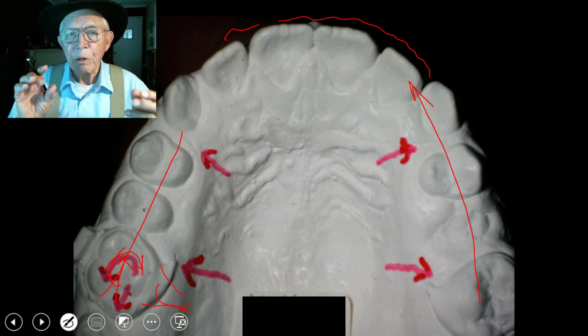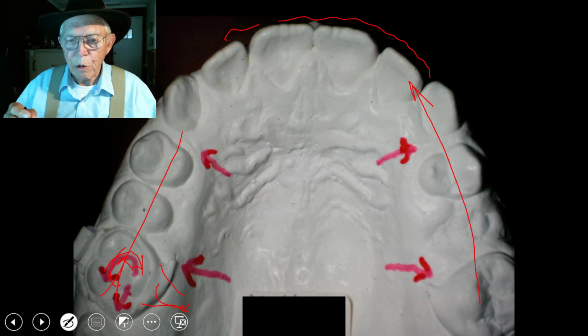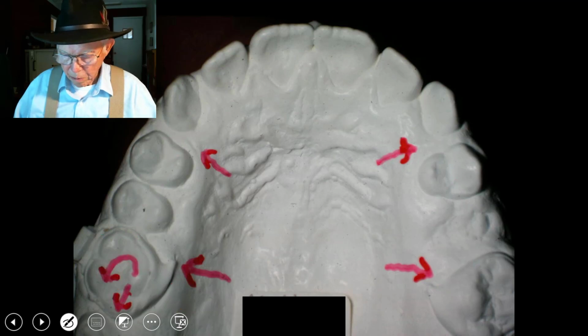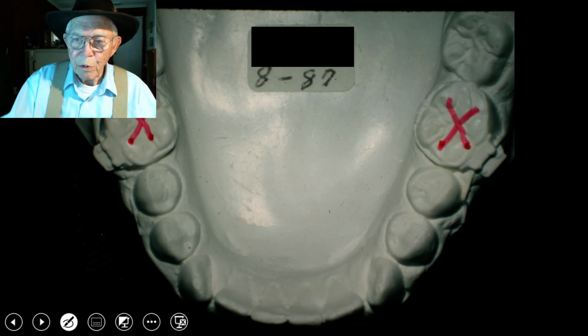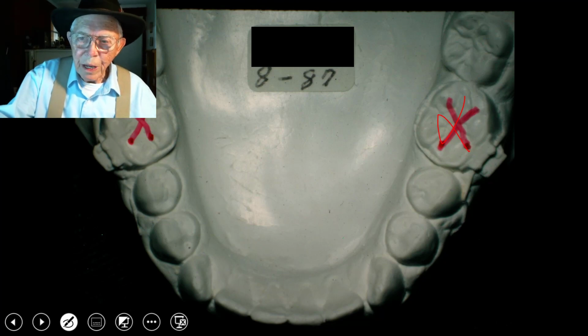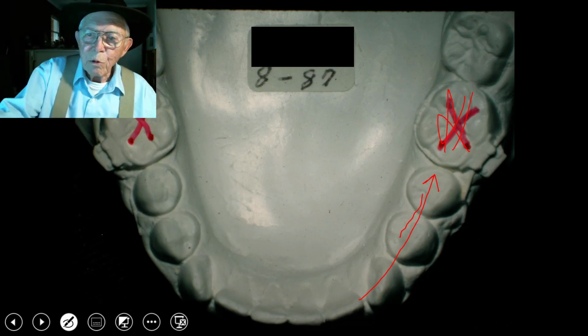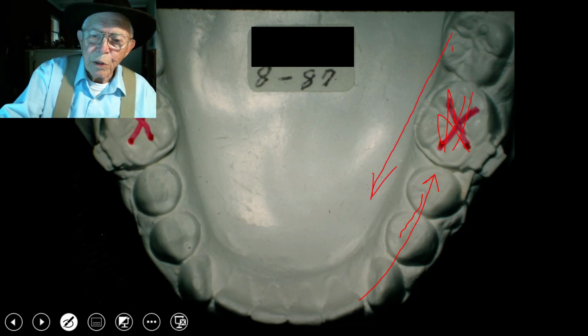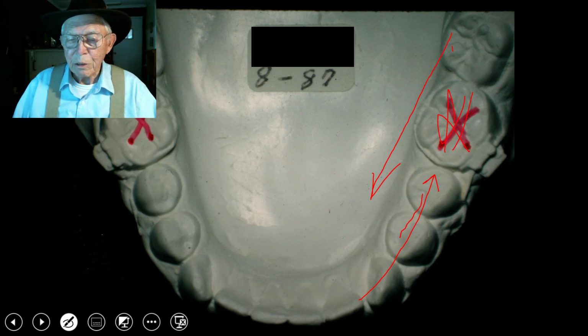And as you're pulling them in there, you can move the lower jaw further back, or you can move the upper jaw more than the lower jaw to correct this thing. Okay, now let's get on with it. On the lower jaw, I'll just show where we're going to extract these molars. And the very day we take this tooth out, we're going to start moving these teeth back into that. So we'll start moving these teeth back on the lower arch, and that will also pull the upper jaw forward. So one comes forward and one goes backwards, and it all takes place at the same time.